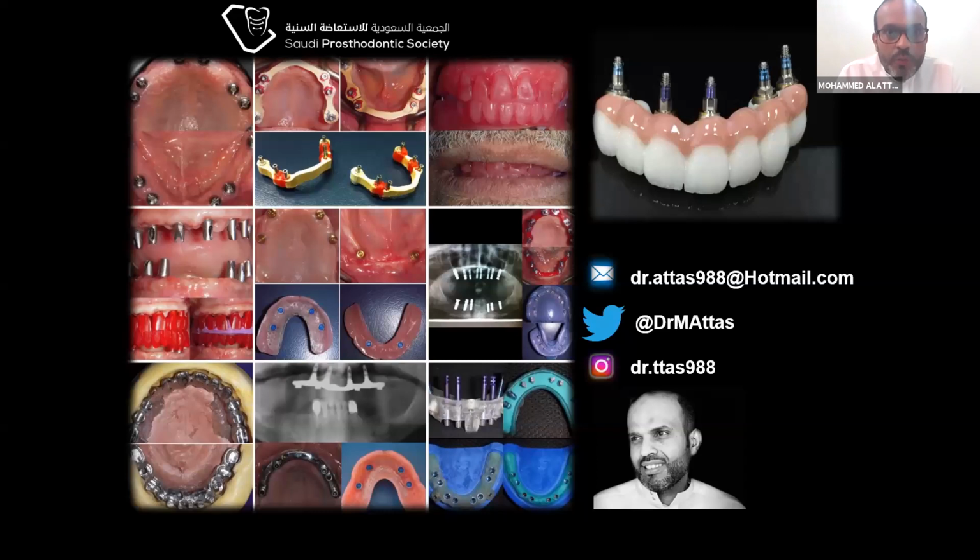Here we have a question for splinting: which material did you prepare? Most of the time we use Duralay because it's easy to handle. We use composite for some cases. We end up with a misfit because I think the composite has high polymerization shrinkage.